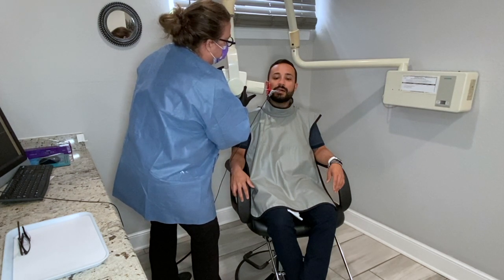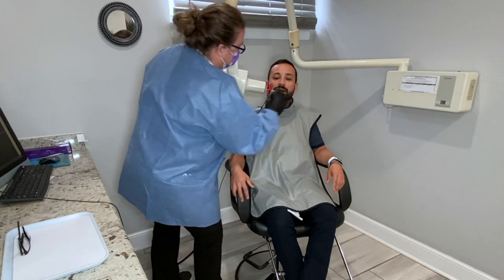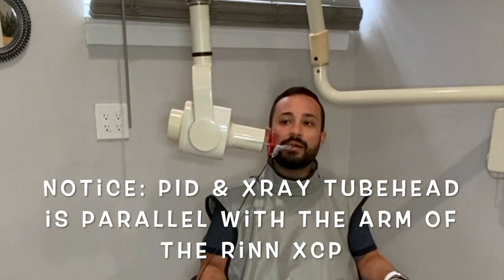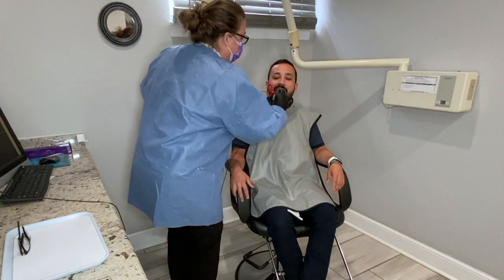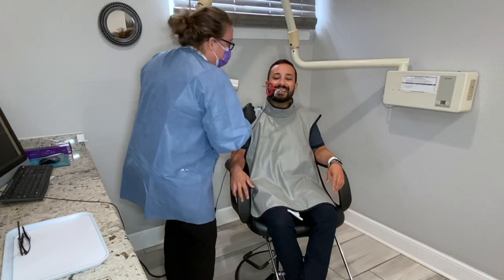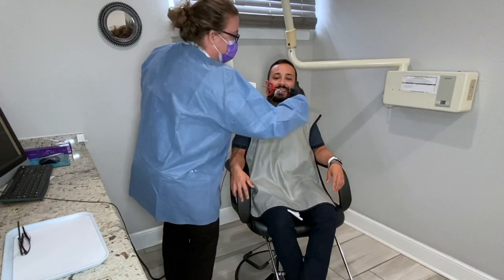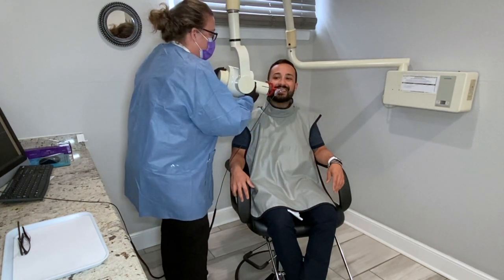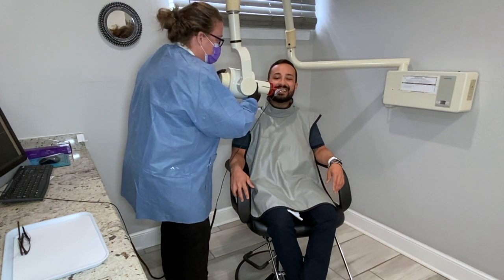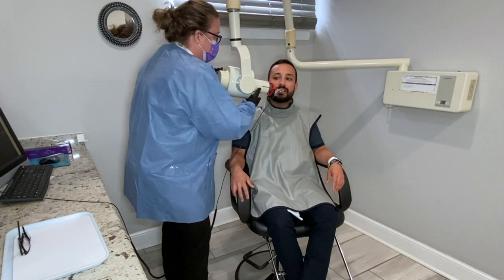This room has a little bit of a drift but we'll get it, no problem. Everything is nice and even — walk out and hit our button. We're going to gently turn it just a little bit forward. Smile for me. Make sure it's in our circle — we have the distal of our canine, and it's just a little bit diagonal so we can get all the teeth and all the interproximals for the doctor.